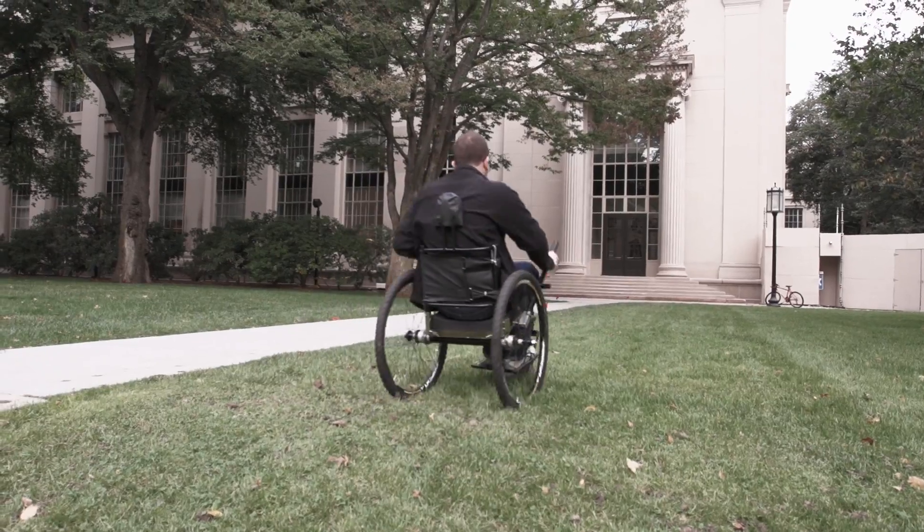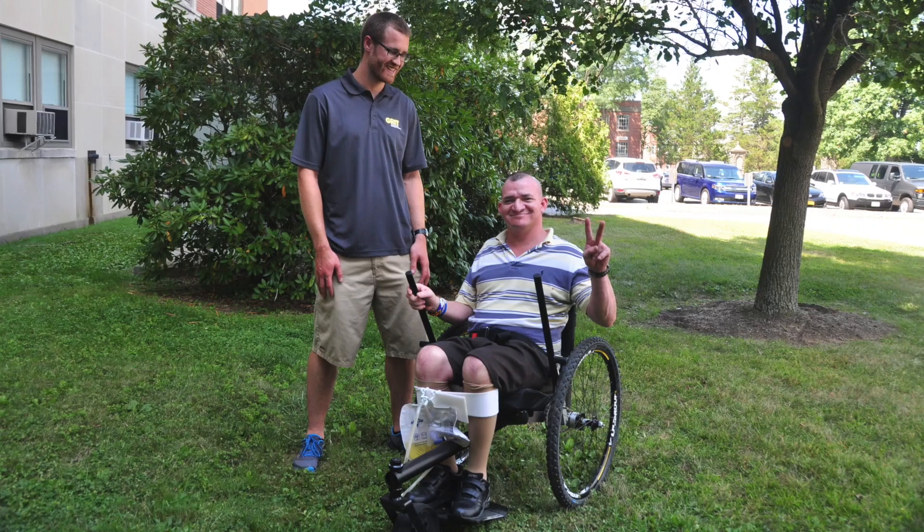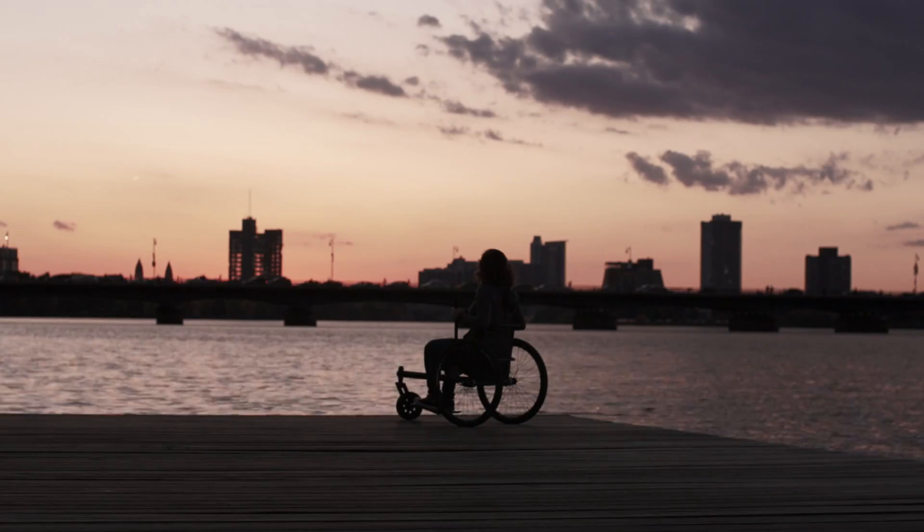There's a whole lot beyond the pavement. And allowing people to get off the beaten path, even if it's as simple as rolling on the grass, allows them a quality of life that we take for granted.